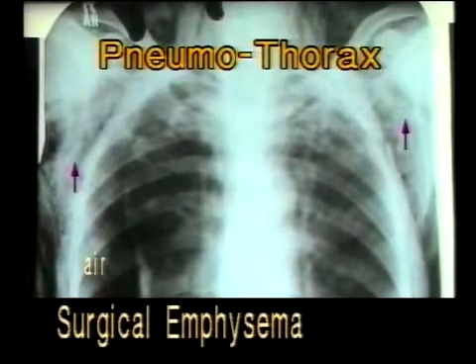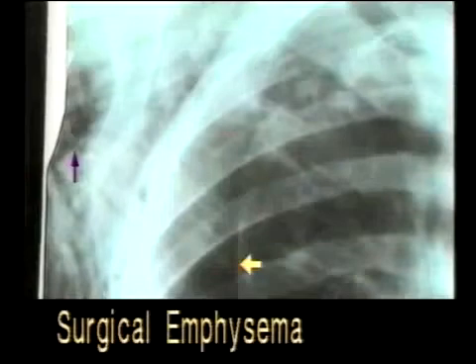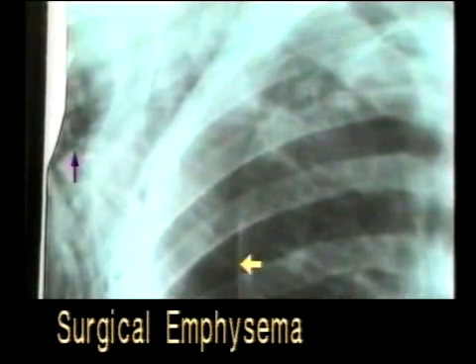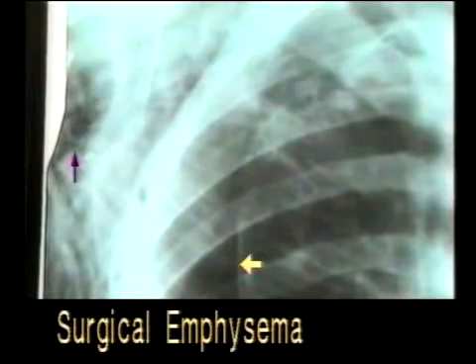In this X-ray, note the pneumothorax on the right side and note the air in the subcutaneous tissues shown by the black arrows. The air in the subcutaneous tissues is termed as subcutaneous emphysema. The black arrow shows the air delineating the subcutaneous tissues and the muscles, and the white arrow marks the lung border, lateral to which is the radiolucent shadow of pneumothorax.